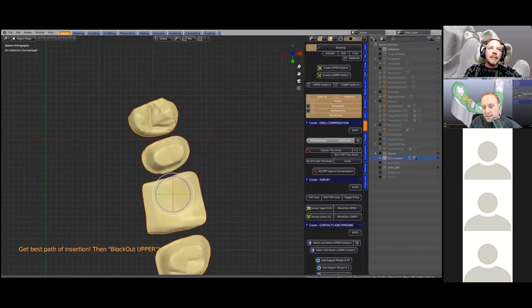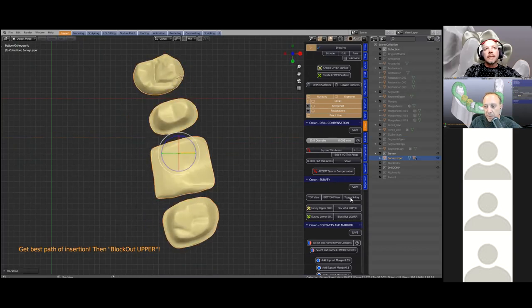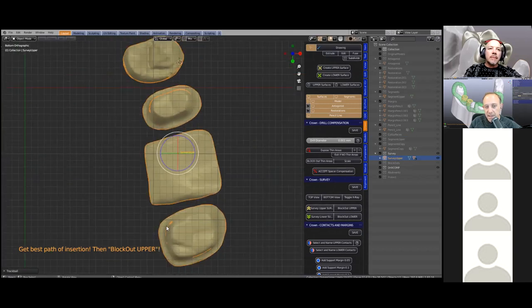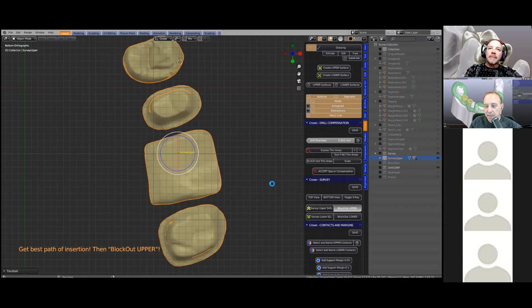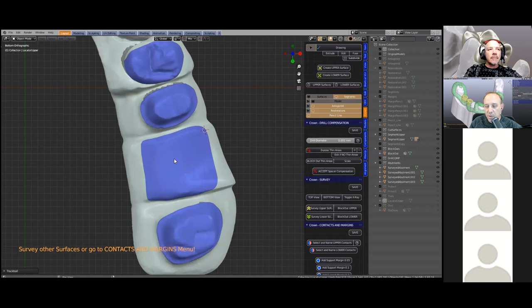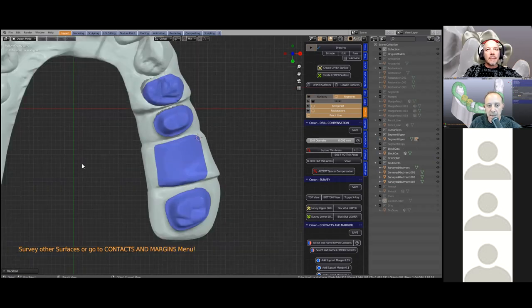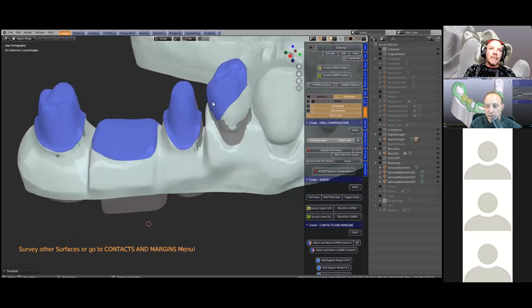The next step is surveying — looking at the surfaces from the top to find a good path of insertion. By going into transparent view you can actually see where the little undercuts are — Michael's just pointing to them. He's going to push the block-out button, and that will change the scene. Michael will show the gray underneath — it makes little blocked-out thimbles on the underside of these surfaces.